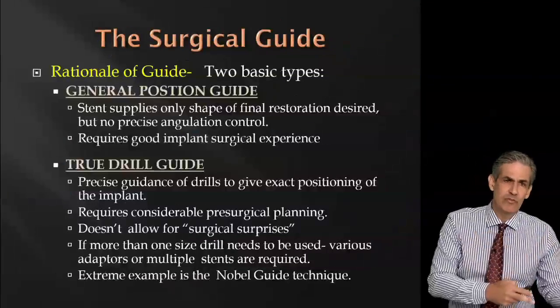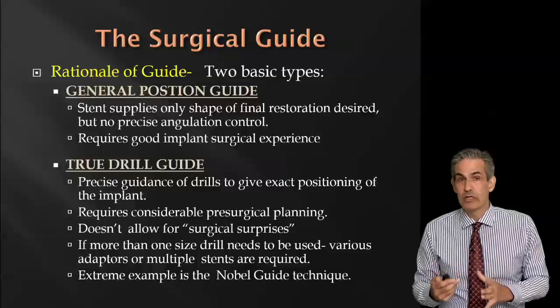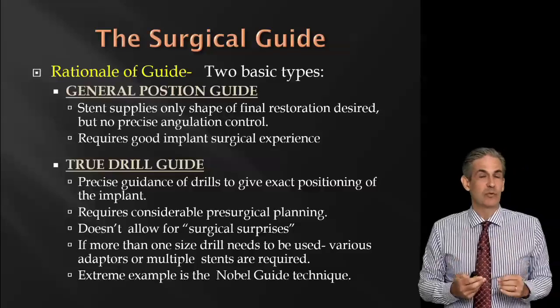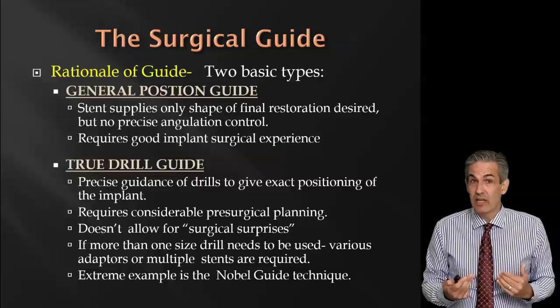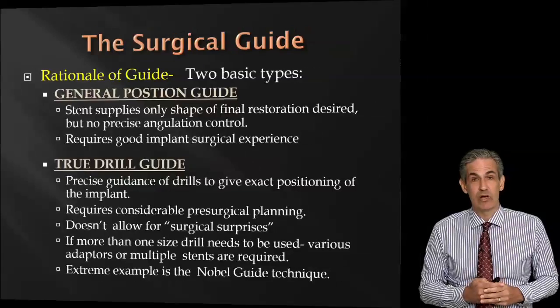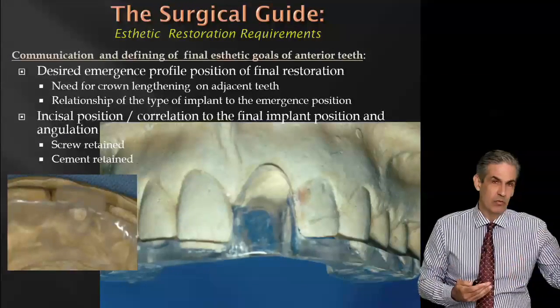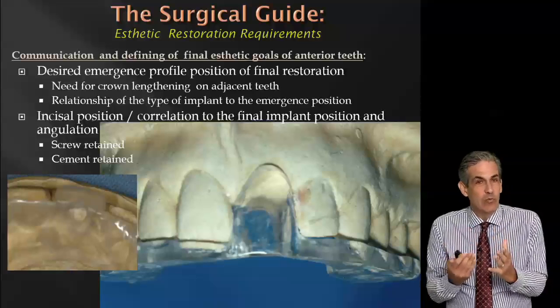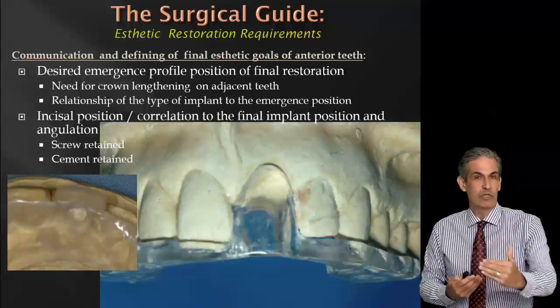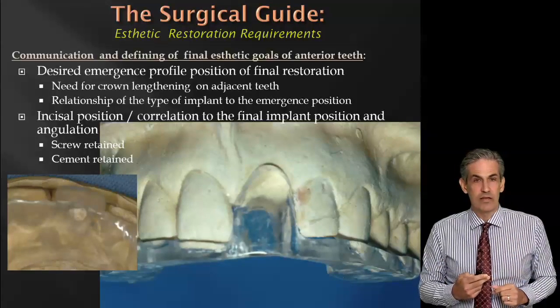We do 2 different kinds of guides. We do general position guides and a true drill guide. These are interesting, but it always requires us to understand what our limitations are as surgeons, if we're the surgeon, and to create a guide that will serve those purposes. We like to communicate to the surgeon, if we're working with a surgeon, exactly what we're trying to achieve. Is it screw retained? Is it cemented? Where do we want the emergence profile of the crown? All of that can be done with a good surgical guide.